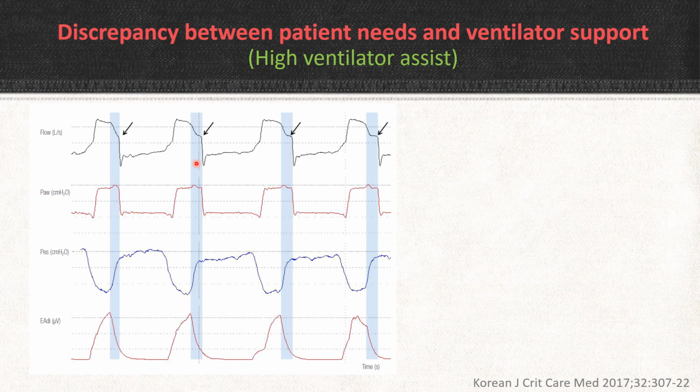So, ideally pressure support can be set at 10 or 12; 10 can be a beginning pressure support. Alternatively, whatever peak pressure or PIP or pressure control you have set, you can set a pressure support of 2/3 of the pressure control. Say if you set pressure control of 15, then 2/3 of 15 is 10. So, you can set 10 pressure support and adjust accordingly after observing the patient's demand. If the patient demands more, then you can increase to 12, 14. If the patient is feeling high assistance and tidal volume delivery is too much, you can reduce it gradually.